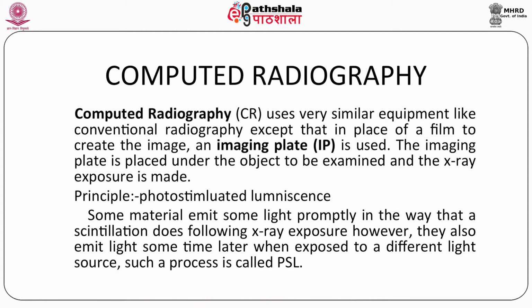CR image acquisition, as you can see in the figure, has been described. The patient is standing, and the PSP records the latent image formation, and then this latent image is read out by using a digital image reader.